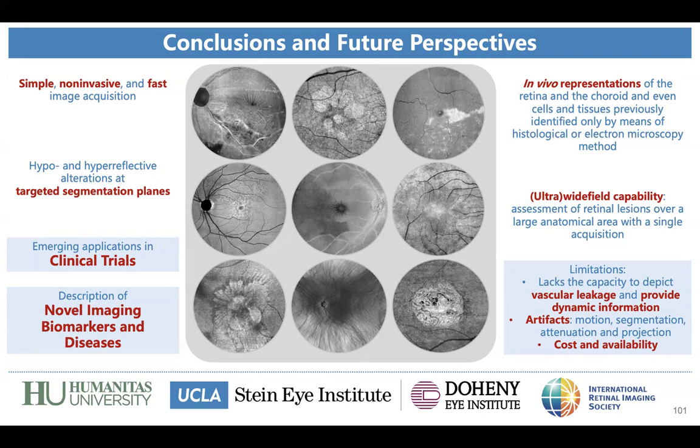I think these are very important limitations also for research and original studies, because it's difficult to collaborate with other centers that have different devices. And so it's difficult to acquire and collect data, for example, on geographic atrophy or hypertransmission defects or drusen volume and so on, in terms of using different devices across different centers. That's why standardization in this field is so important. So yeah, absolutely, it's a very important observation.